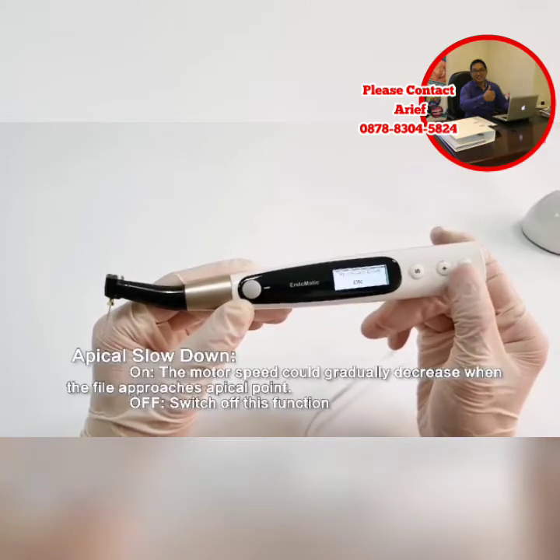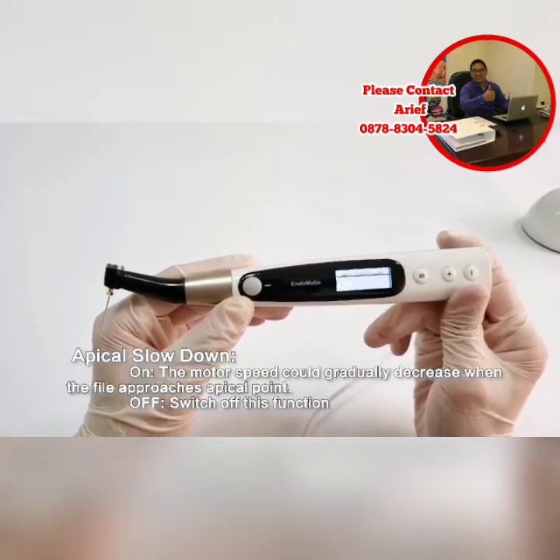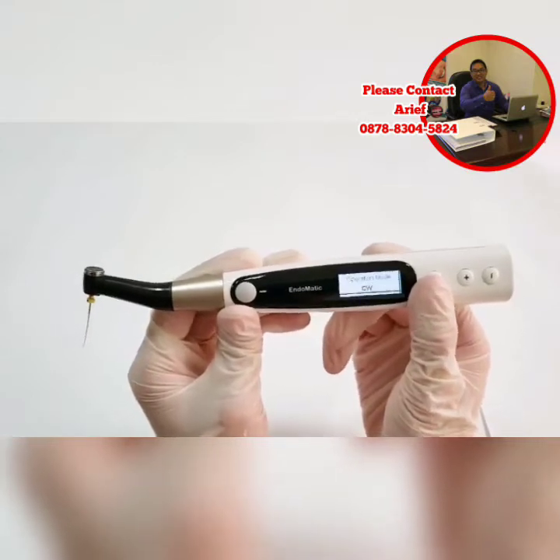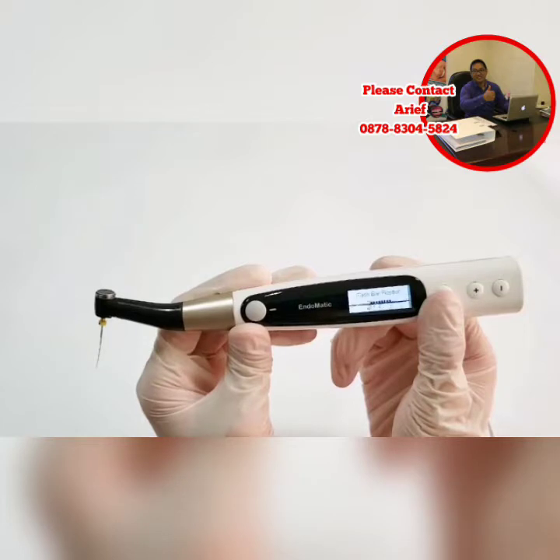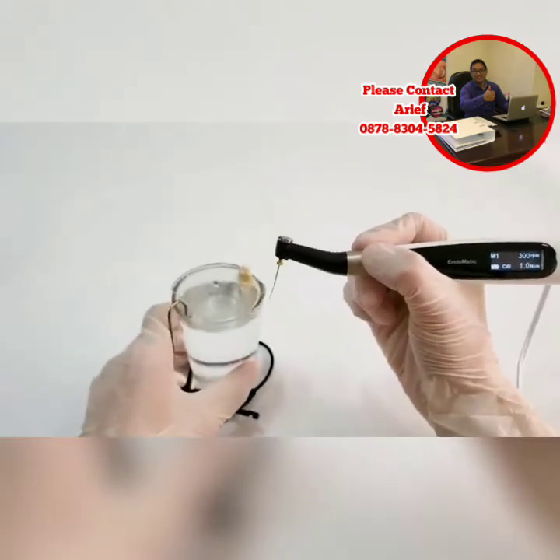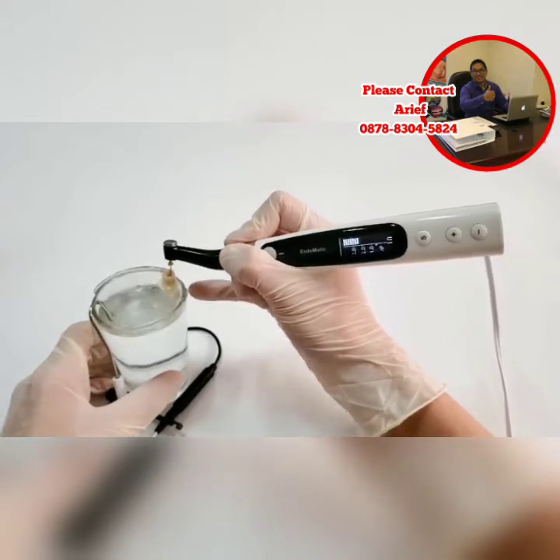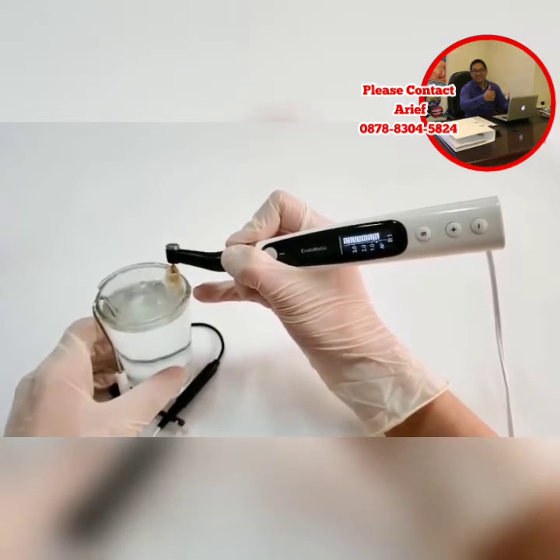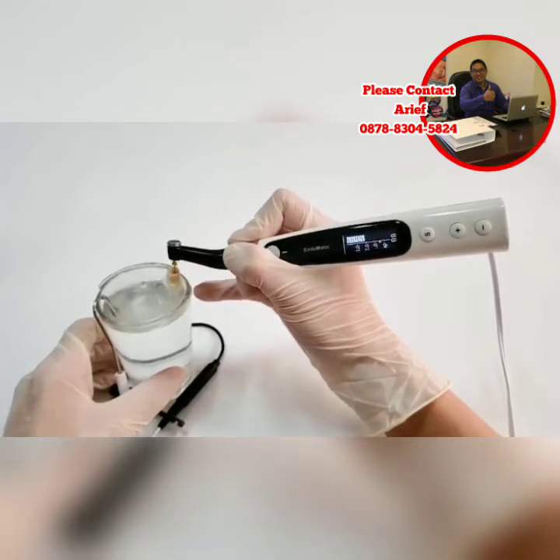The last small function is apical slowdown, with On and Off modes. If you switch to On, the motor speed gradually decreases when approaching the apical point. Now let's select settings: apical action — select Reverse mode; auto start — switch On; flash bar position — select physiological apical foramen; slowdown — switch On. Here is the simulator. You can see when I put the file in the root canal, it works automatically. When the file approaches the apical foramen, the speed reduces. When it reaches the apical foramen, it reverses automatically. Thank you.